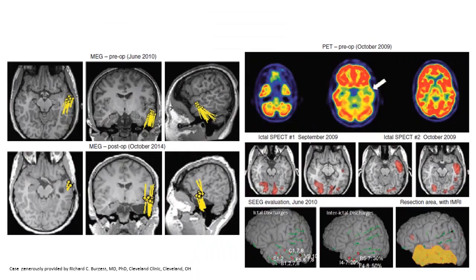This is a case study from a drug-resistant epilepsy patient who had seizures, which began as a young child. They were characterized as type A, where there was right hand jerking but maintained awareness, as well as an inability to respond, and type B, where he had an increased heart rate, which was followed by dialeptic seizure. He had no epilepsy risk factors and a normal MRI.